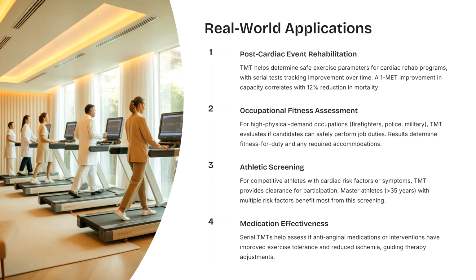Next, medication effectiveness. Serial TMTs help assess whether anti-anginal medications or interventions have improved exercise tolerance and reduced ischemia, guiding therapy adjustment. So these are the real world applications, and all should be kept in mind. Number one is post cardiac event rehabilitation, occupational fitness assessment, athletic screening, and medication effectiveness.